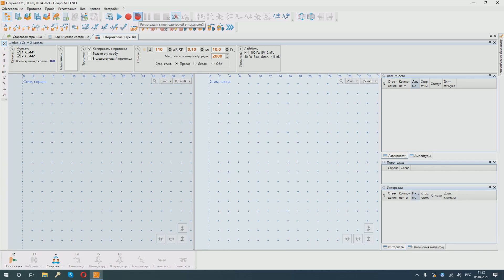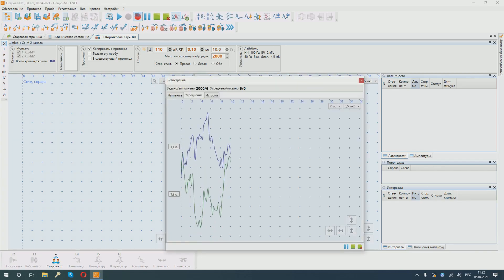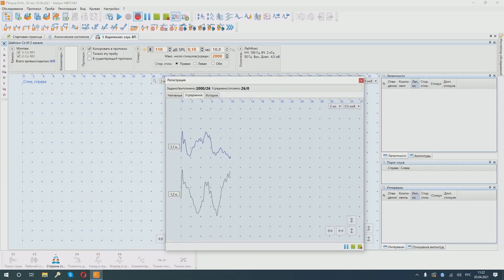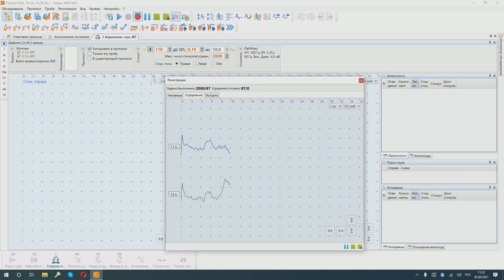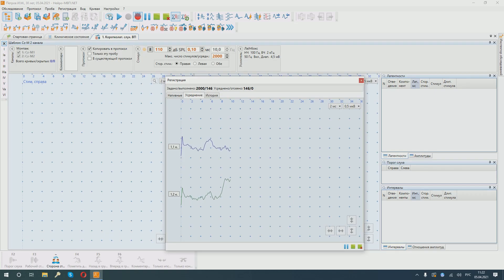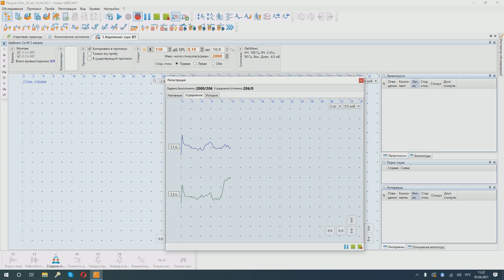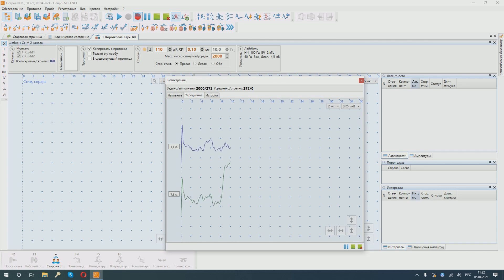We see that the curves are displayed both on the Ipsy side. In this case, it is the second channel. And on the contralateral side, we can see how many stimuli are presented and how many responses are averaged. You can change the scale of the curves, if necessary, for a more detailed view.